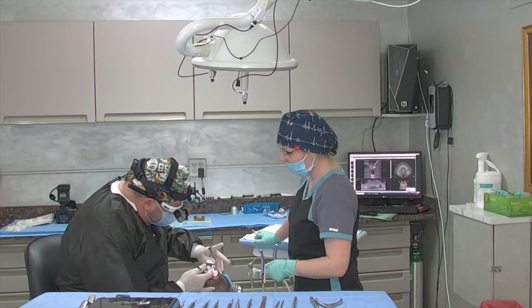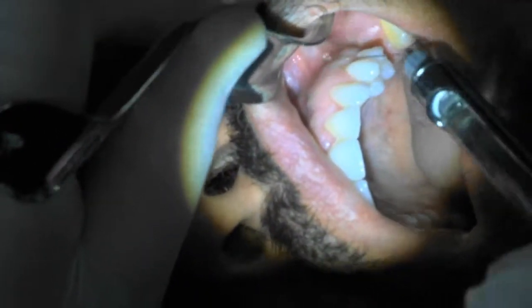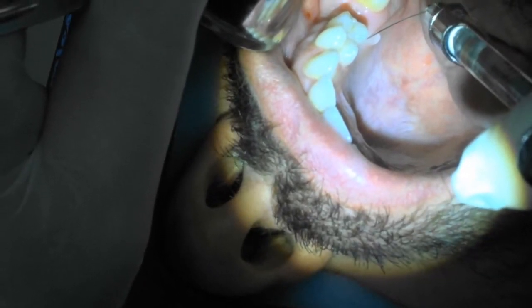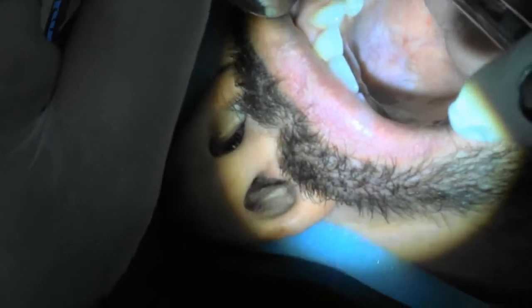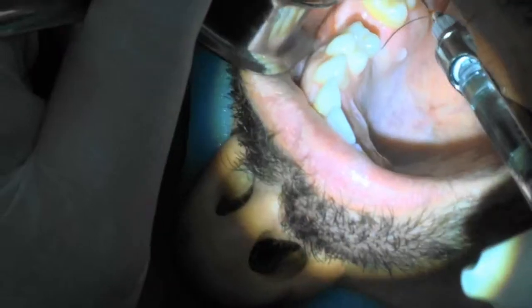Doing okay? What I'm going to do too, I'm going to get an occlusal mirror that we could put in from a vision standpoint. A little pinch. There we go. That'll be a little pinch on the inside, okay? Apologize about this here. Doing okay? Still feel that? Okay, tell me when it's gone. How about now? Likewise, tell me when it's gone.